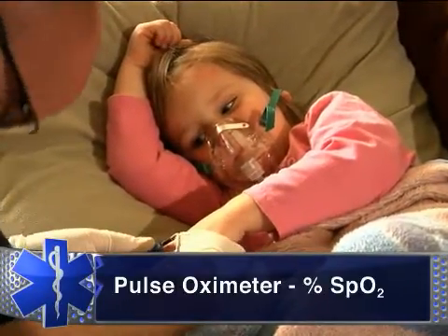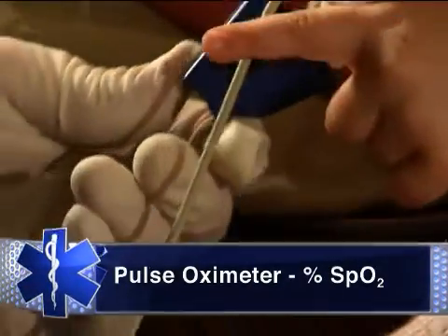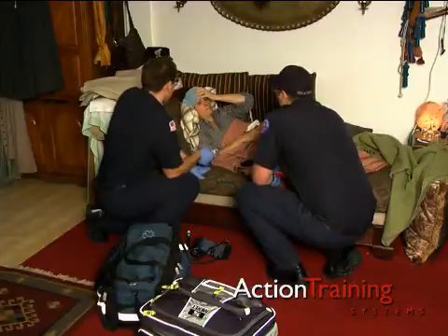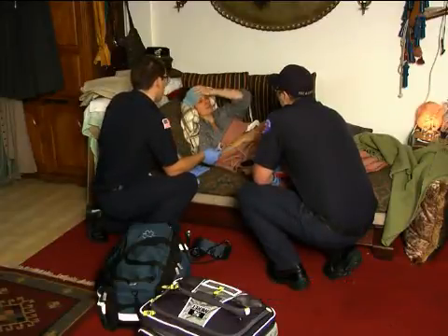The pulse oximeter, sometimes called the sixth vital sign, is a device that continuously measures the pulse and the level of oxygen-saturated hemoglobin in the blood. Use the pulse oximeter any time a patient's oxygen status is a concern or you suspect hypoxia.